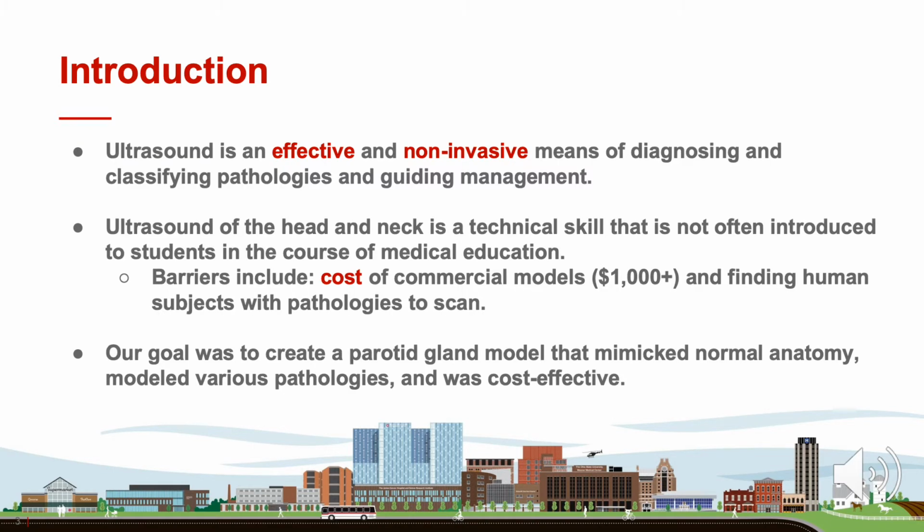For an introduction, ultrasound is an effective and non-invasive means of diagnosing and classifying pathologies and guiding management. Specifically, ultrasound of the head and neck is a technical skill that is not often introduced to students in the course of medical education. Some barriers to introducing this technique to medical students include the cost of commercial models, which can often run in excess of $1,000, as well as finding human subjects with pathologies to scan.